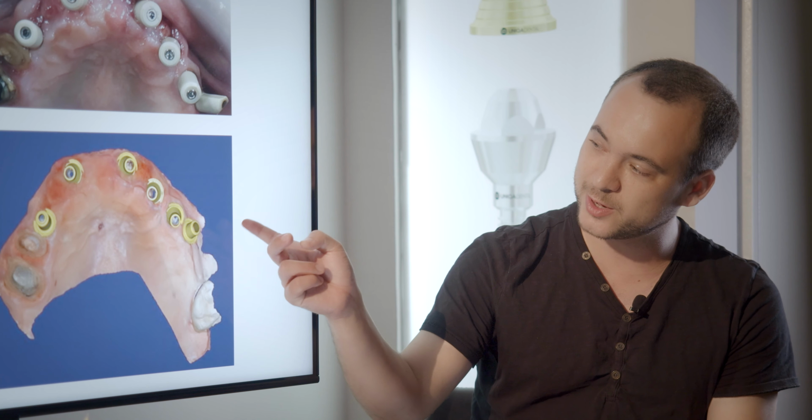If you use angulated multi-units, each type of angulated multi-unit has 6 positions. So here, of those 5 angulated multi-units, only one was taken with implant-level scan abutment. If we took all 5, you have 5 times 6 positions: 30 different positions of angulated multi-units. And even if one multi-unit is in the wrong place, the bridge in the end won't fit at all.